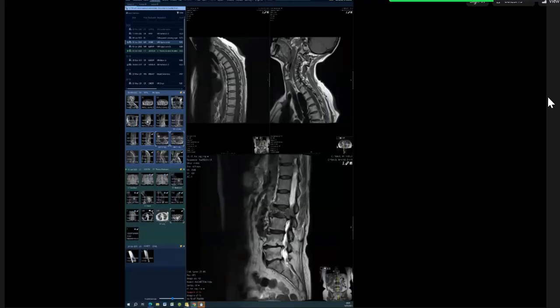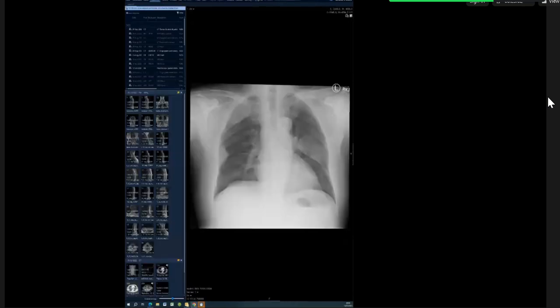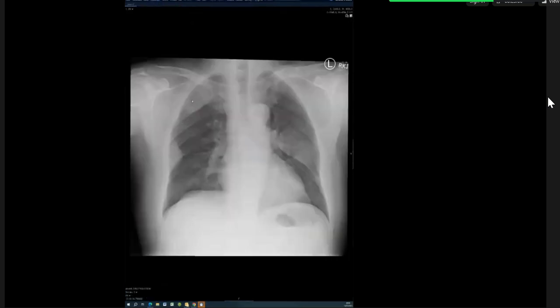Candidate number 4, are you with us? Hello, Dr. Reza. I think you'll recognize. Hi. Yes, I do. Yeah, I will give you a case. Let me bring it up. Can you see the screen?